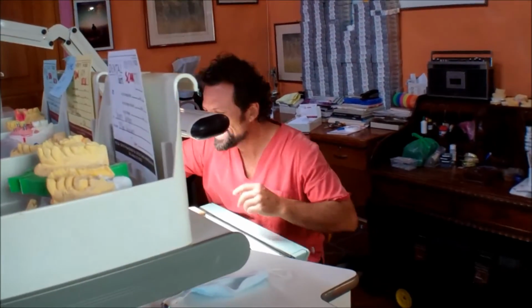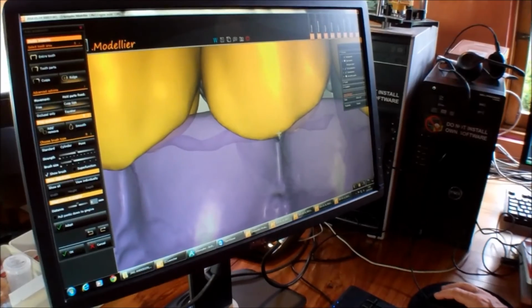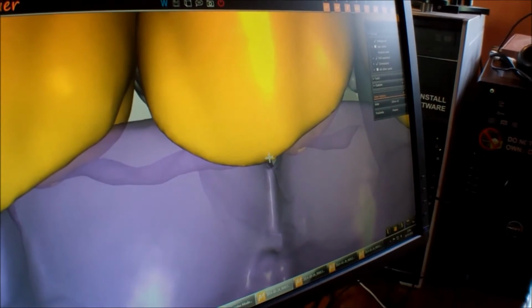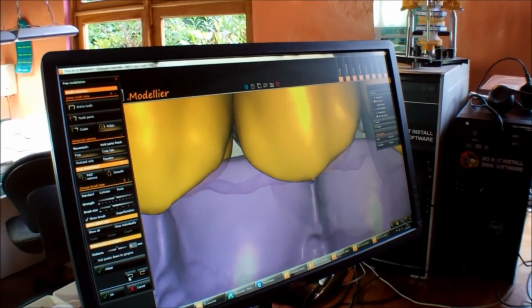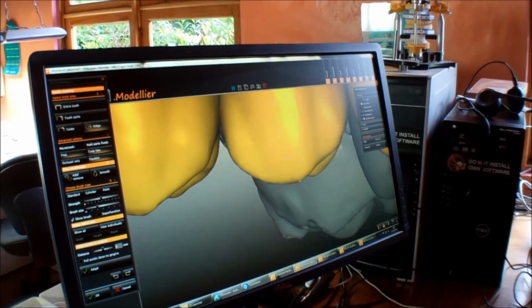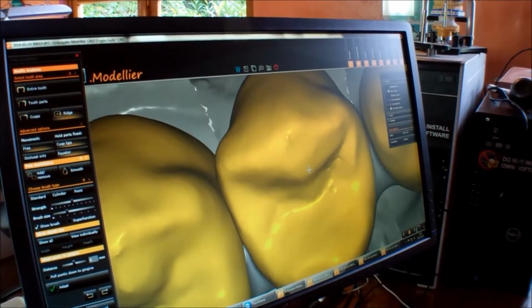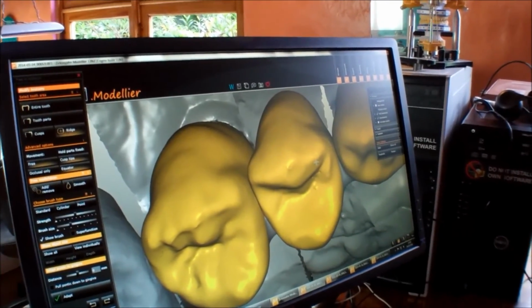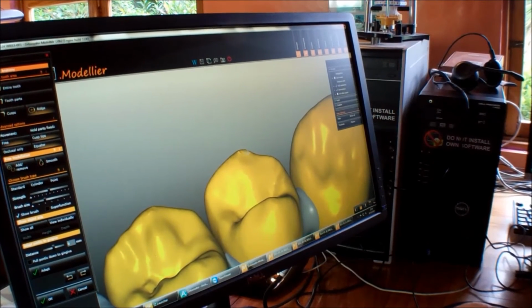Yeah. So you see with the doctor something like this. You see this? This is nothing. If you measure a micron, maybe he touched this. You see, a little touch there, or when you have the work, not only the static part, but maybe the articulation. We did okay, but maybe there are some little microns, for example. I did this one. You see this flat area here? I didn't do that when we had the provisional. He did this in the mouth. So he touched that, to make the bite better. Exactly. Yes. So I see the exact button here.